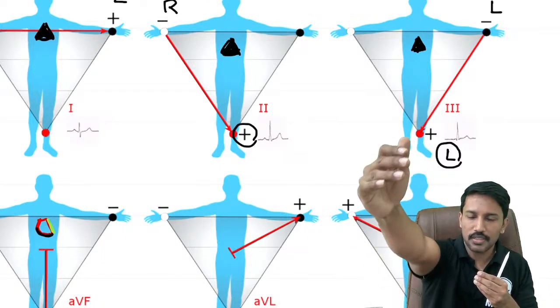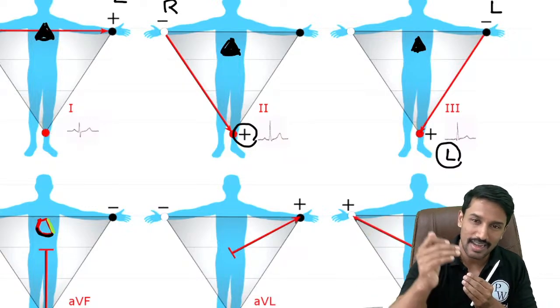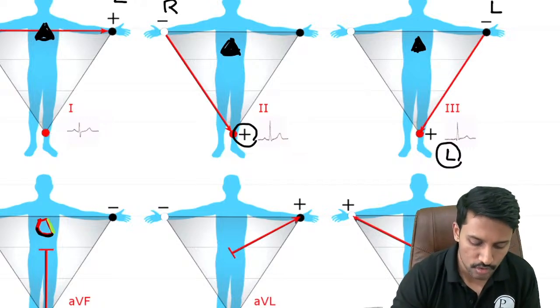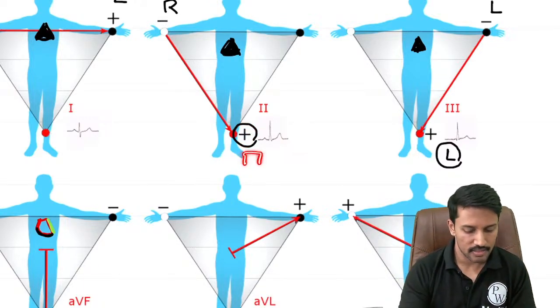If he goes in the opposite direction, the distance between me and that person goes on increasing. So he is making a negative move. If he is coming towards me, he is making a positive move. So we are making a positive move towards the positive electrodes. That's why we say camera is placed here.